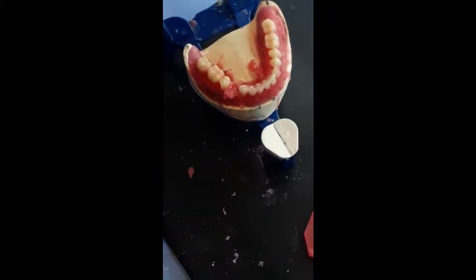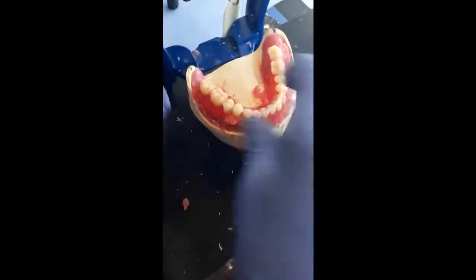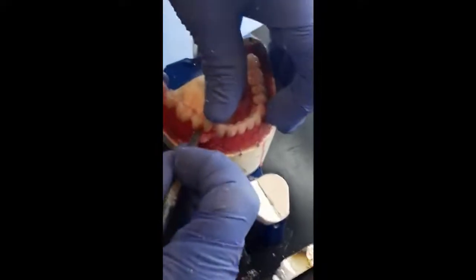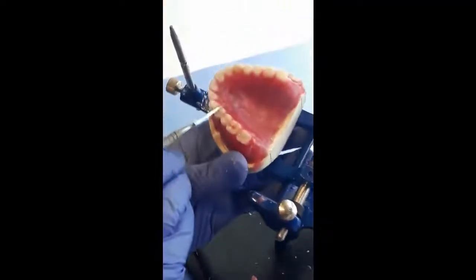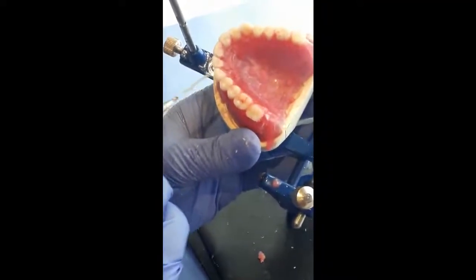Soften the wax and place the first premolar, and you can see that it fits exactly in the size, and this is because we have here space, we have here broken contact between the maxillary canine and the maxillary first bicuspid.